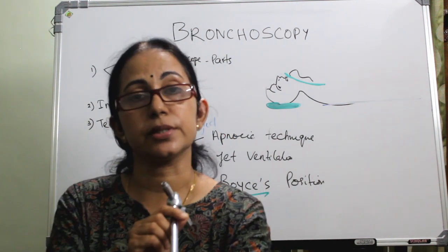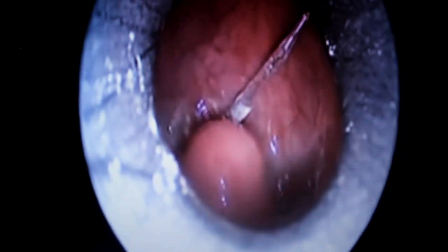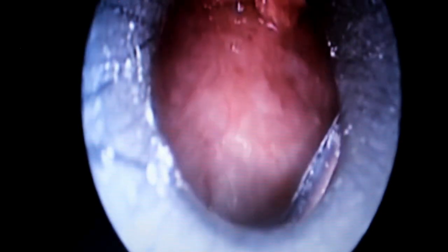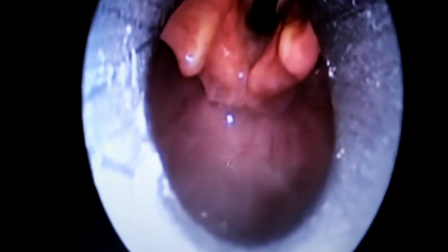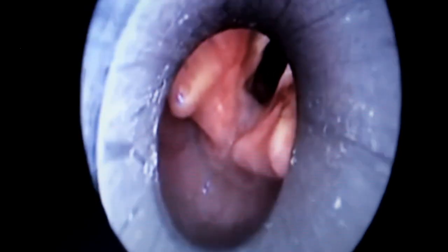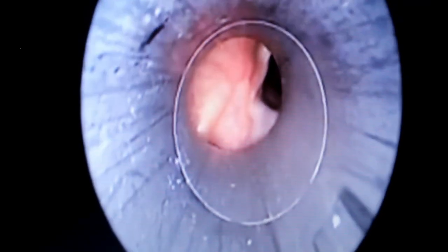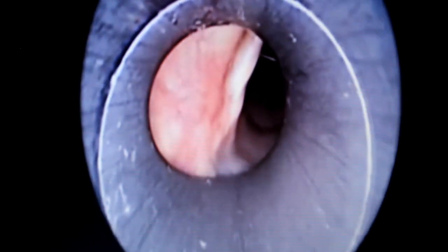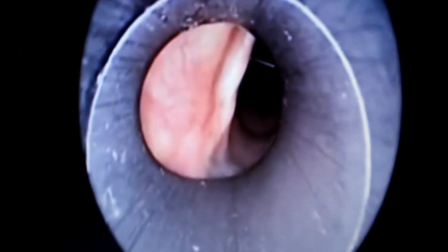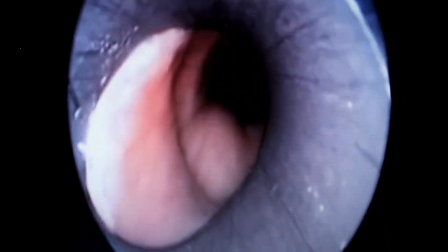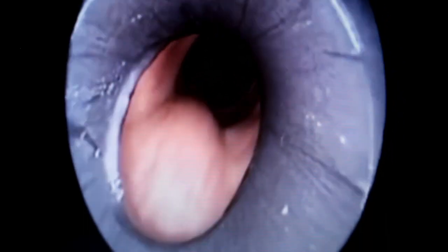Once you see the uvula, elevate the epiglottis with the tip of the bronchoscope to visualize the vocal cords. On reaching the vocal cords, turn the scope in a clockwise direction to pass through the vocal cords into the subglottic area and reach the trachea.